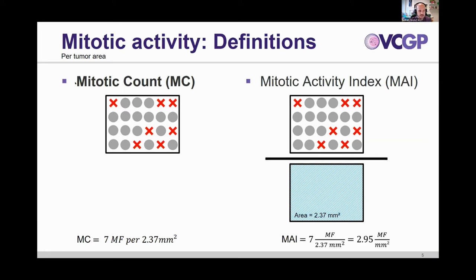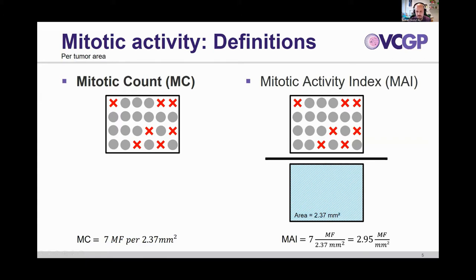The mitotic count is done routinely, even though it's often called mitotic index. We should use the term mitotic count. For mitotic count, we count mitotic figures among all the other tumor cells within a specific area. As previously detailed, we would like everyone to count or evaluate 2.37 square millimeters. So the mitotic count for this image would be 7 within 2.37 square millimeters. The mitotic activity index is very similar — you divide by that area — so the mitotic activity index would be approximately 3 mitotic figures per square millimeter.